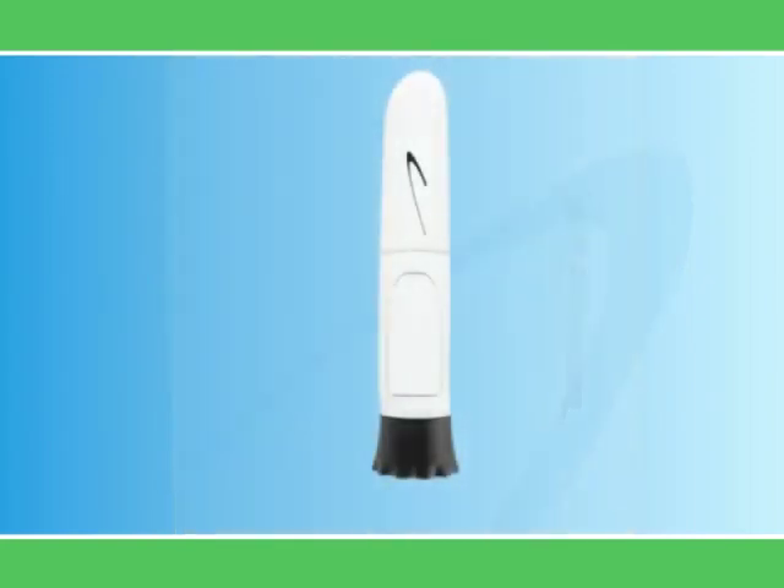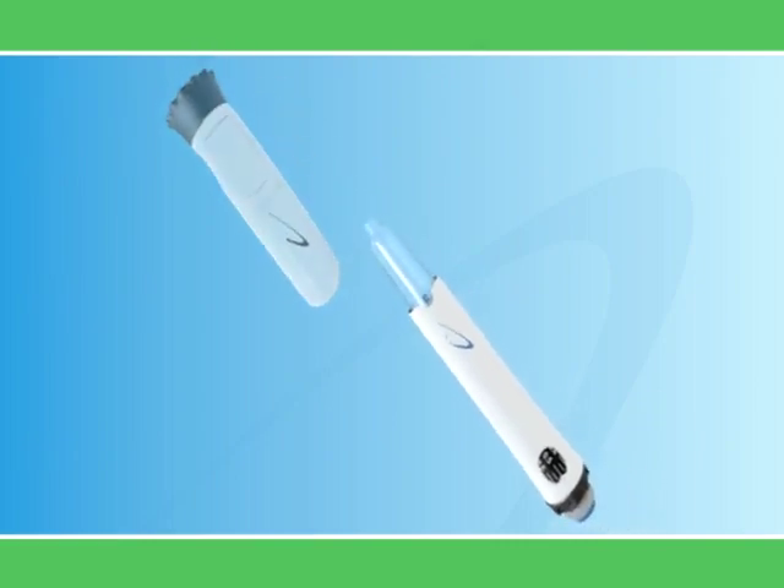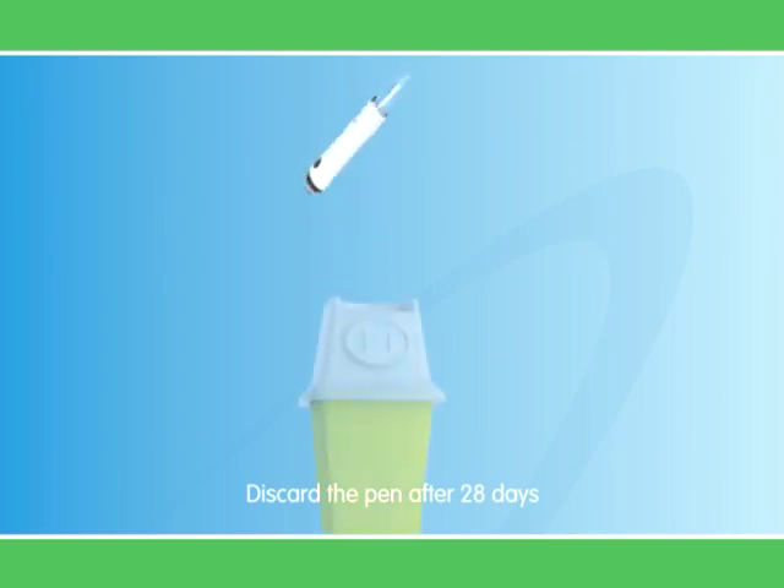Remember not to throw away the needle guard — it is reusable and designed to last, so you only get one needle guard with your starter kit. This reduces the amount of waste. Each pen lasts up to 28 days once mixed. After 28 days, discard the pen, even if some medicine is left. It's important to note that depending on the dose of growth hormone required, more than one pen may be used during the 28-day period. Your doctor or nurse will discuss this with you.